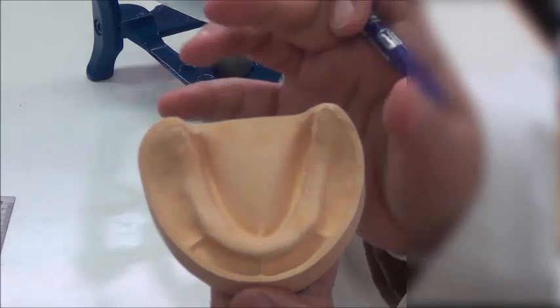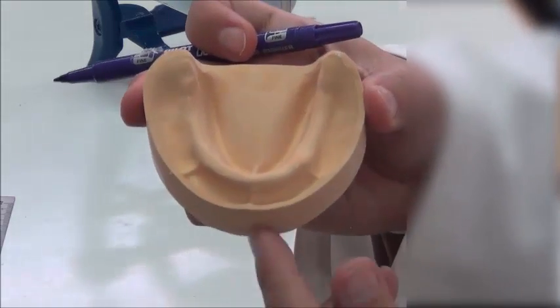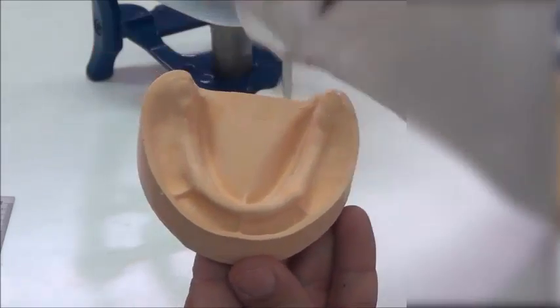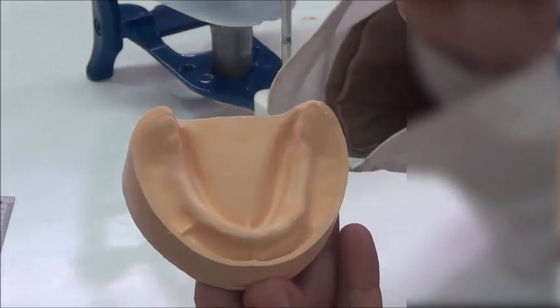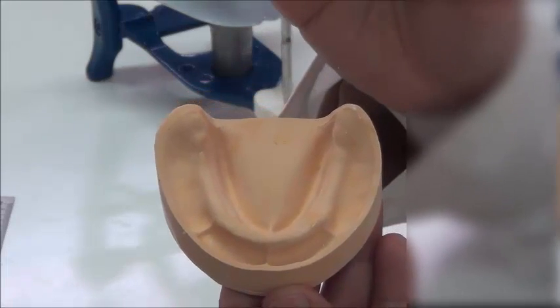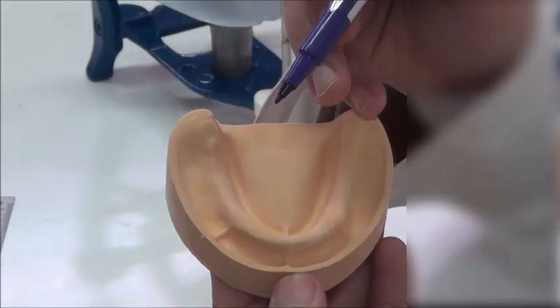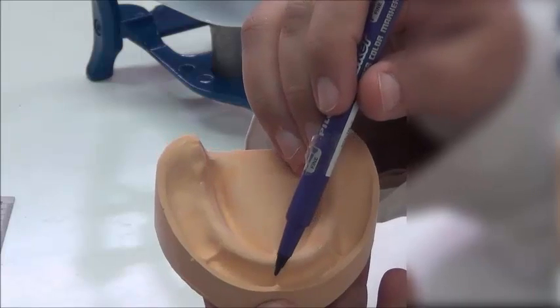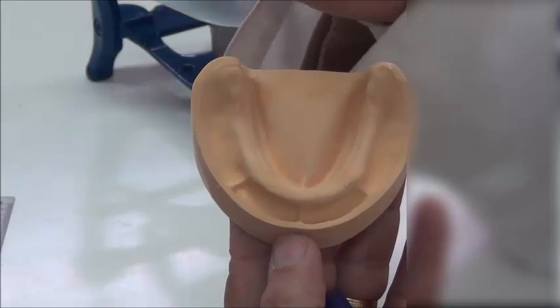For the lower, I'm going to repeat the procedure. Bring two lines in the back and one line in the front. So I need to know what is my reference. Once more, if I want to use the labial frenum as my reference, it would not always be correct in many patients. It might be correct on this ideal model, but in many patients it might not be correct, because this attachment is not fibrous as the upper. It is actually muscular. So sometimes in some patients, this is even wider than this frenum. So we want something more reliable.